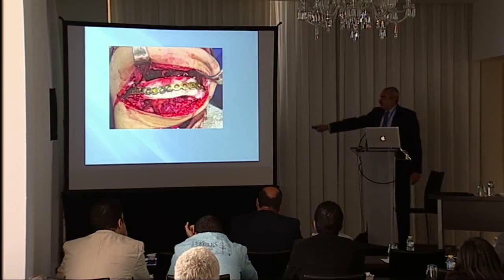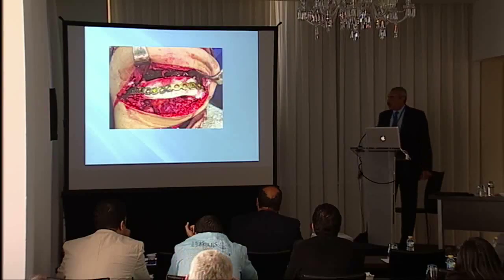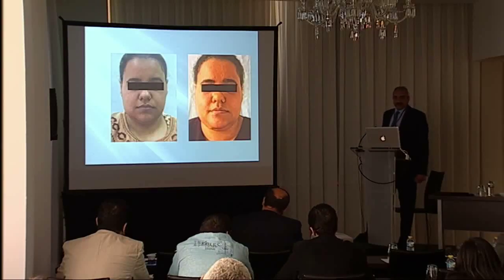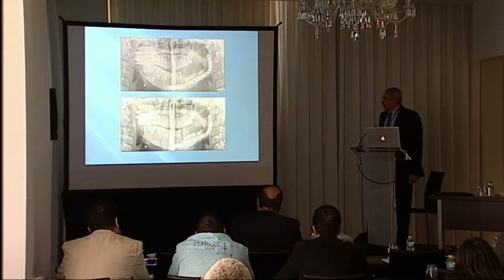And here, after we fixed, we placed the bone substitution material that was loaded with BMP2 and bone marrow extract. Then we can see the patients. You see a little puffy here, and that is usual with the use of the BMP. Sometimes this puffiness lasts for as many as 4 to 6 months postoperative.